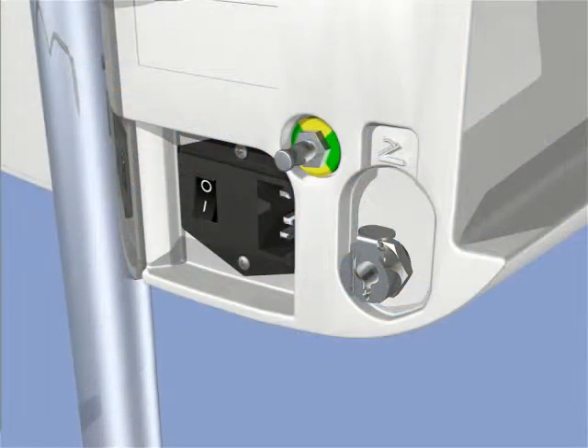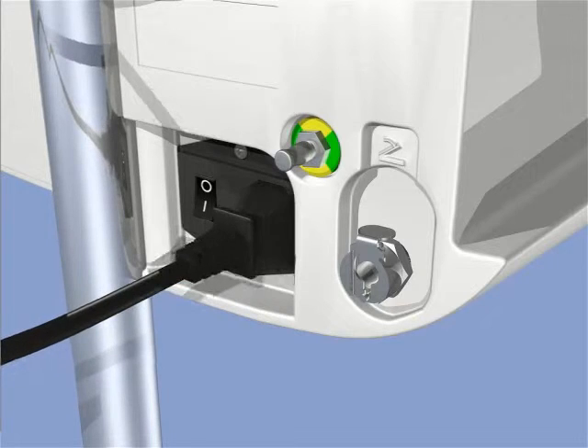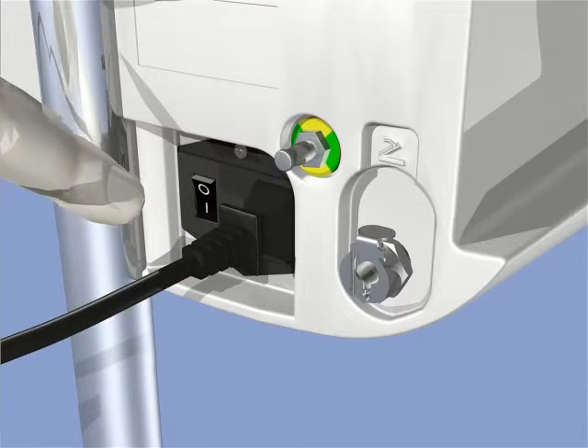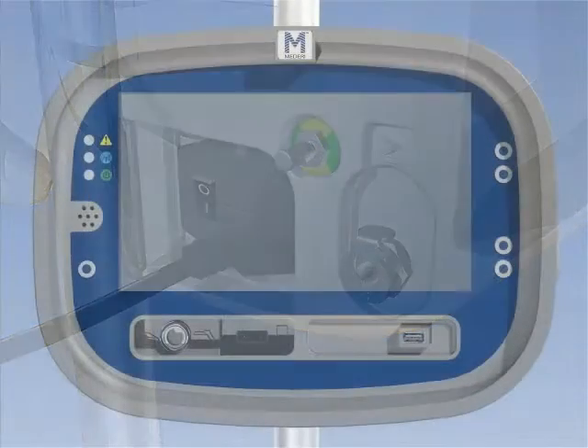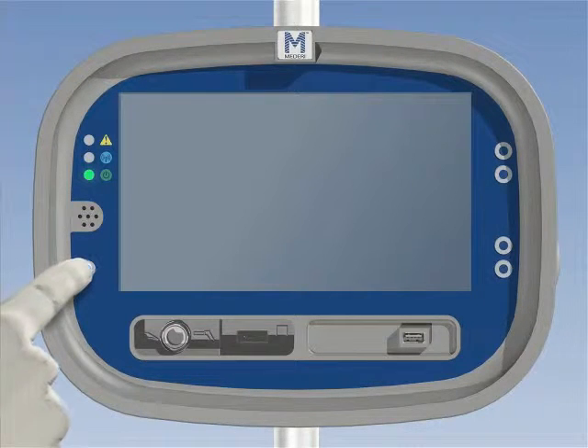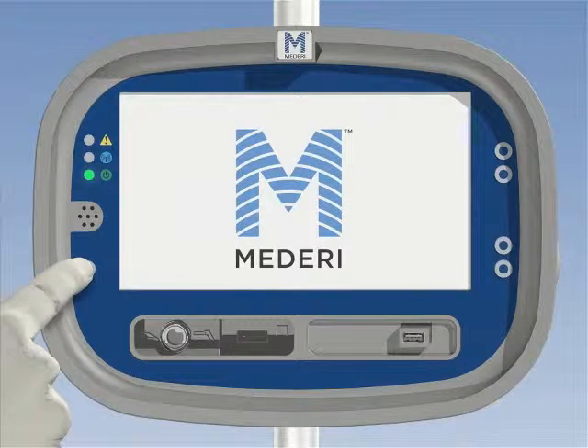After installation, plug in the RF generator and turn on the main switch on the back of the unit. A self-test will automatically commence. The red, blue, and green LED lights will be active. When the red and blue lights go off and the green light is flashing slowly, press and hold the power on mode button for at least 3 seconds and until the Mederi logo appears. The generator will automatically go into setup mode when it is ready.